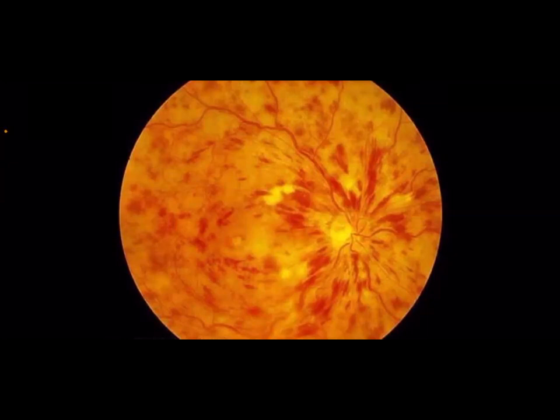So these findings are not necessary, by the way. You just have to mention to the examiner that this patient has got diabetic retinopathy. The type of diabetic retinopathy is proliferative retinopathy because he did laser therapy. This is far more than enough. And the examiner himself, he will not need more than this.